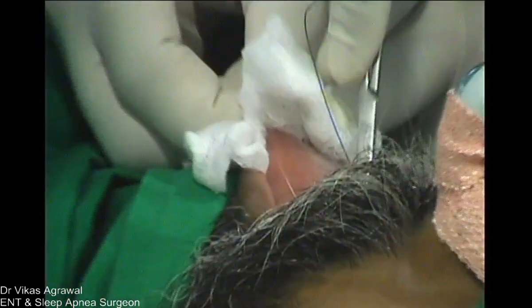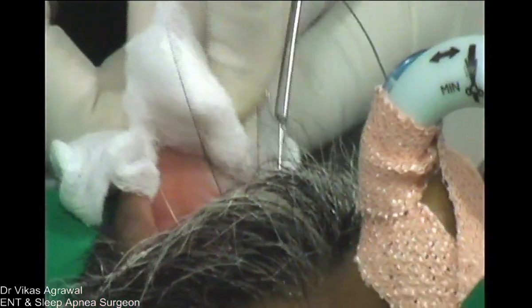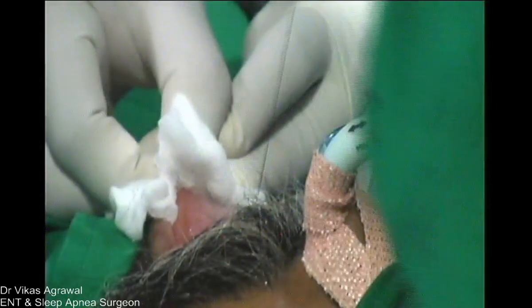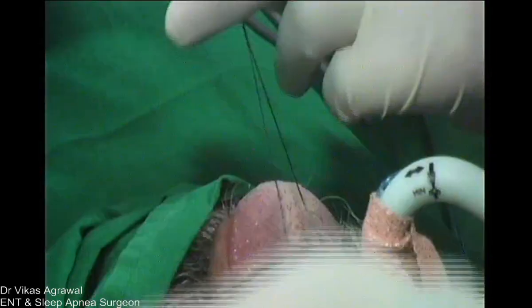I don't know if you are able to show it. A simple tongue stitch in the midline to keep the tongue protruded outside. Okay, and he'll take it on an artery forceps. Take it on a mosquito.